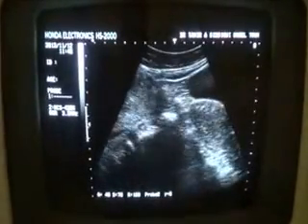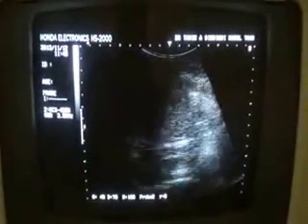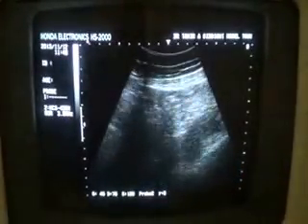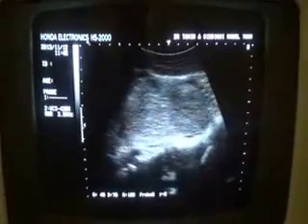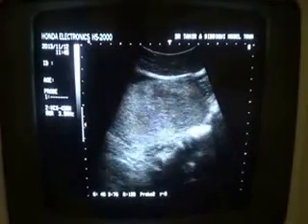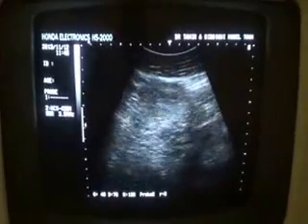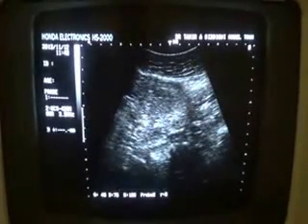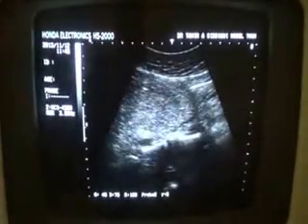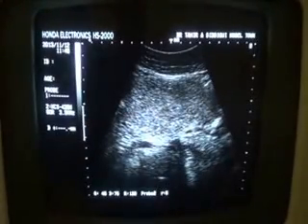And this mass extends from the region of the right adnexa up to the lumbar region in the midline, and also expands in the region of the right lower abdominal quadrant, with iliac vessels seen coursing posterior to it. These are the iliac vessels, and this is the mass.